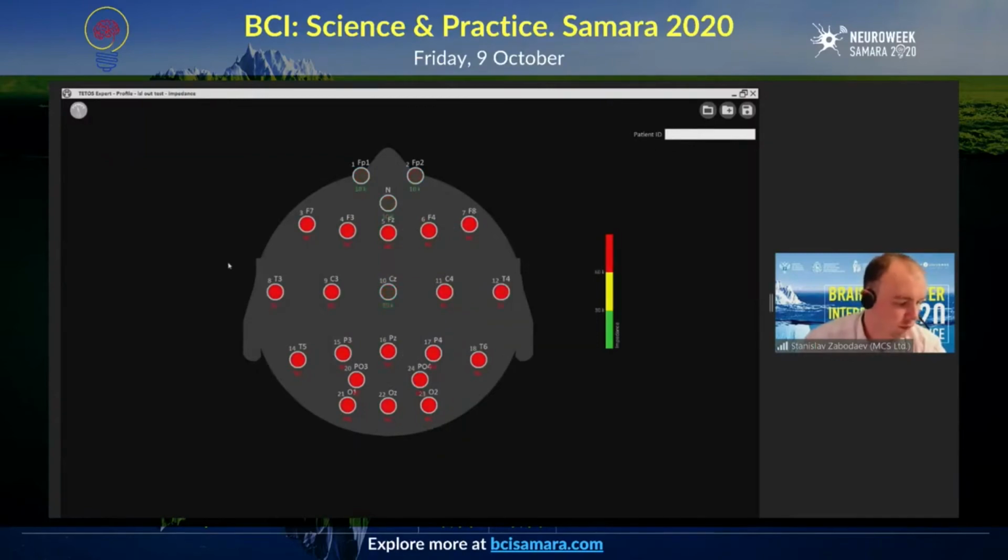And let me show you how it works, especially taking into account all of the constraints that I had talked about. Let's say we wanted to stimulate FP1. Let's put an anode to FP1 and a cathode to FP2.